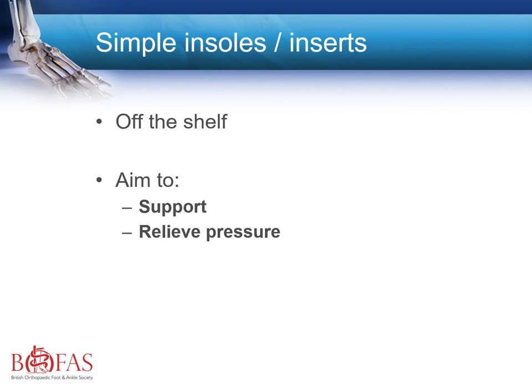Simple off-the-shelf lightweight insoles can provide some support and relieve some pressure. However, because of their softness, they can provide very minimal biomechanical support and therefore can only be used for fairly mild deformities.